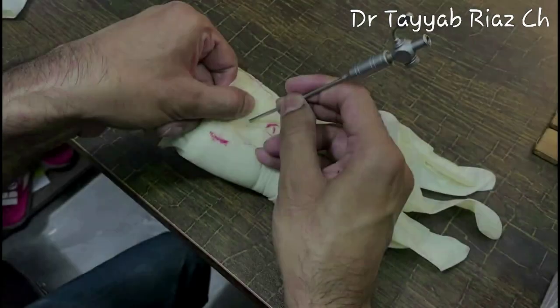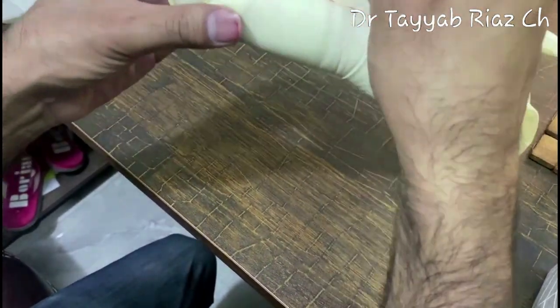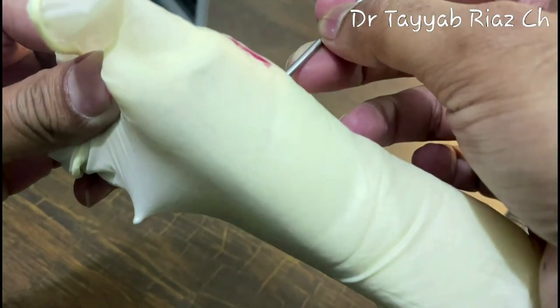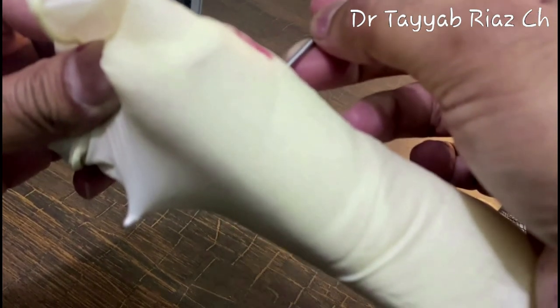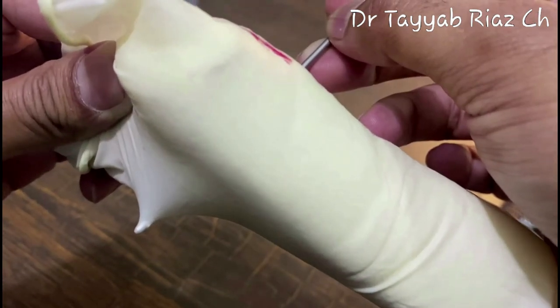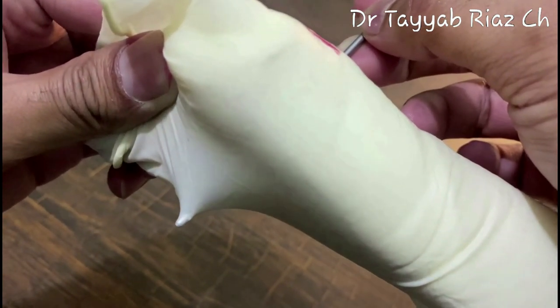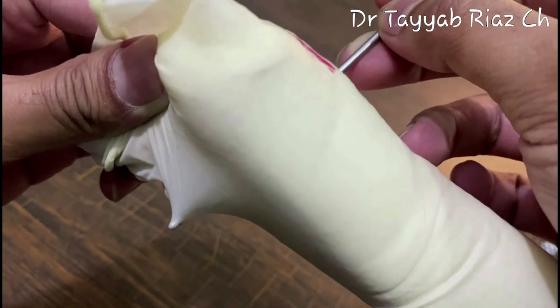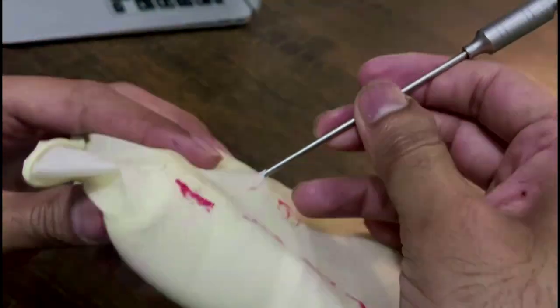And why add 4 cm? After you insert the needle and it reaches the peritoneum, you see there is tenting. This tenting of the peritoneum is 4 cm. That's why we added 4 cm to the original thickness of the abdominal wall. If we don't add this 4 cm, then the needle will not pierce the peritoneum and enter the abdominal cavity. Now after pushing, it punctures the peritoneum and enters the intra-abdominal cavity.